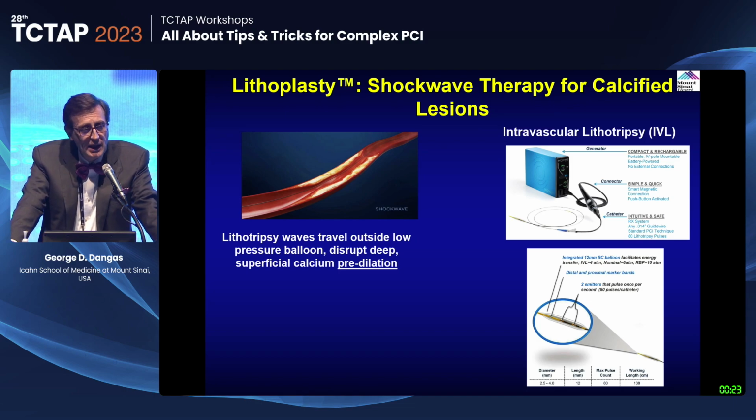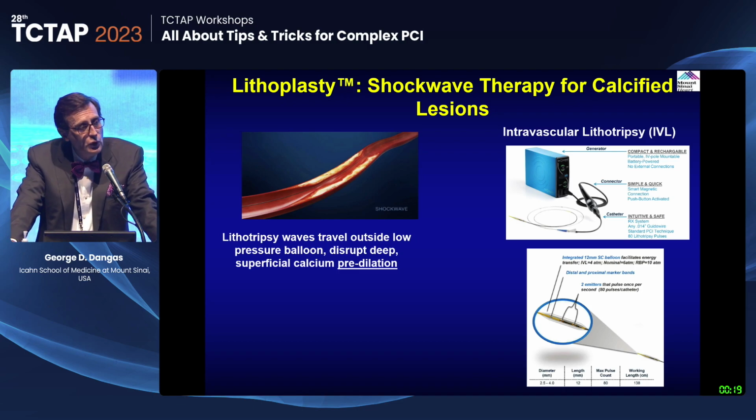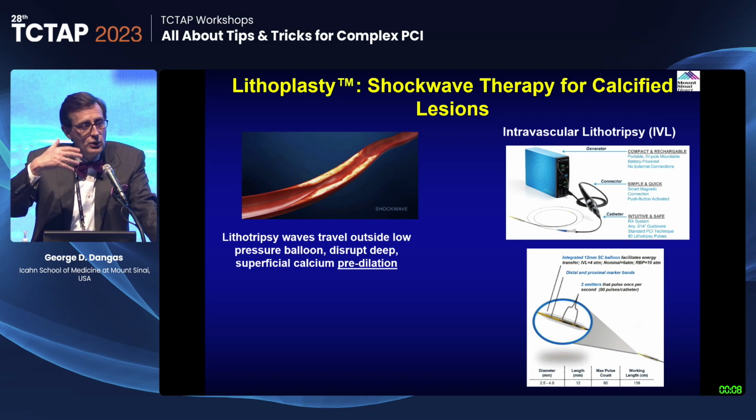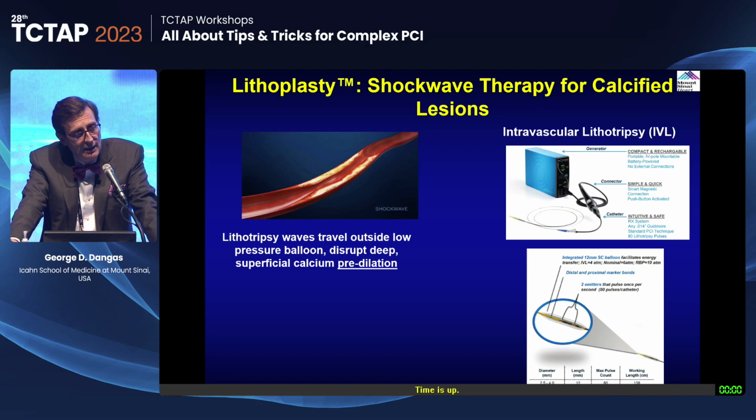It's particularly helpful that it can even be used in combination with an atherectomy technique if you're treating a very large vessel. So you're starting with a small vessel burr, and then sure, you use a 1.5 burr, and the vessel is 4.0, 4.5. Then what are you supposed to do? You cannot really ablate to that level, and perhaps you would not be able to expand a stent up to 4.5 if you only dilate past an initial burr or an orbital.